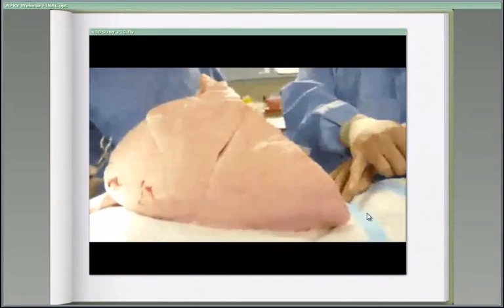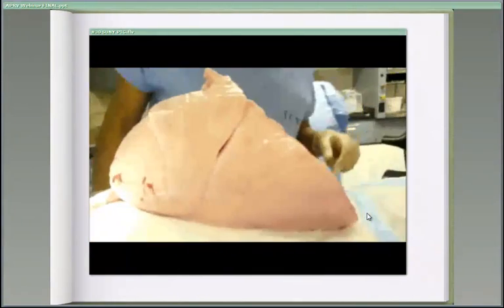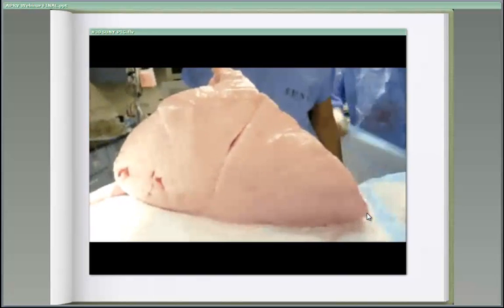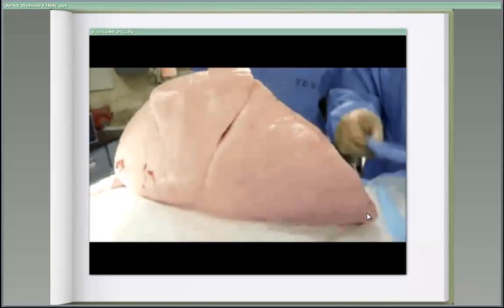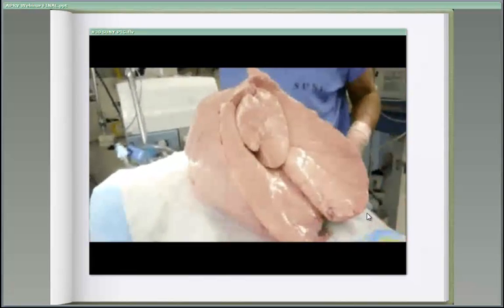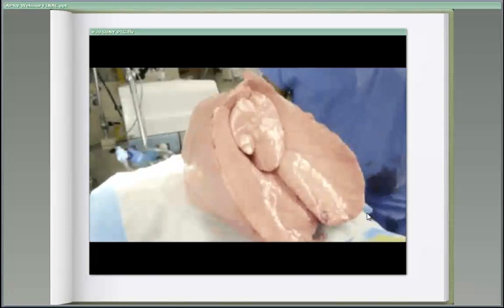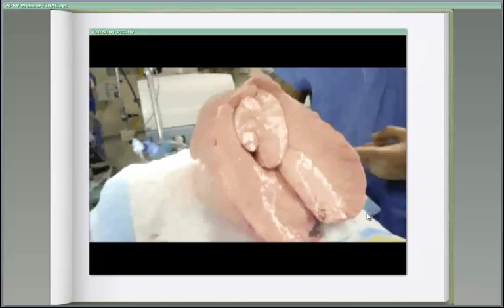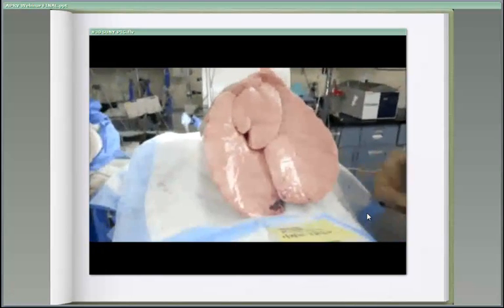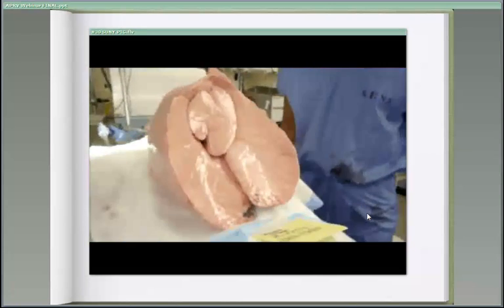Now, the important thing to remember here is we're releasing from a CPAP, I believe it was about 24 here, to a pressure of 0. And of course, many people would say that should result in high amplitude ventilation and a lot of stress injury and a lot of airway closure. But what people are forgetting is that you can control end expiratory lung volume with time. So you can see that the lung barely moves. The lung barely winks from its CPAP position to its release. And so the lung volume is actually very, very stable.